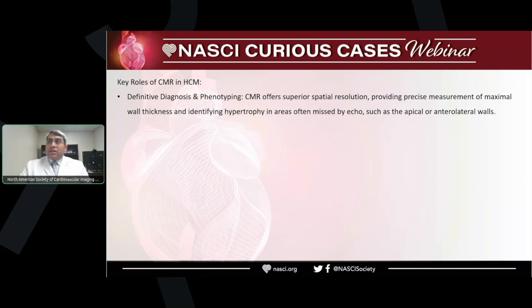In the thickening, we mentioned that 15 millimeter and above is considered significant thickening of the myocardium. Above 3 centimeter or 30 millimeter is also considered high risk for developing arrhythmias. Not as sensitive as the enhancement, but the thickening of the myocardium can also put a risk for developing sudden cardiac death.